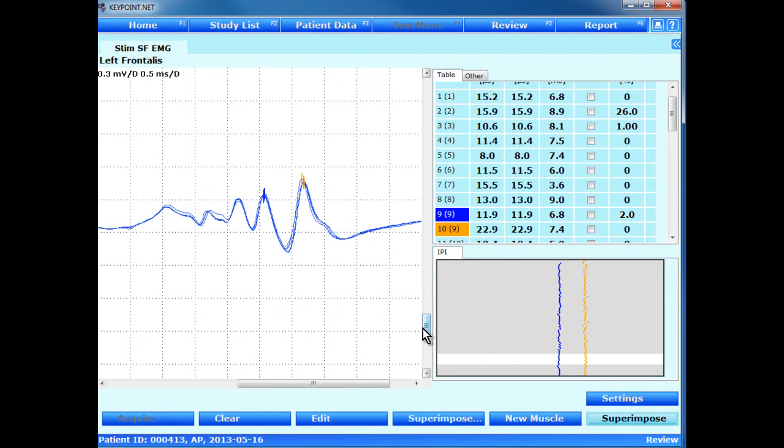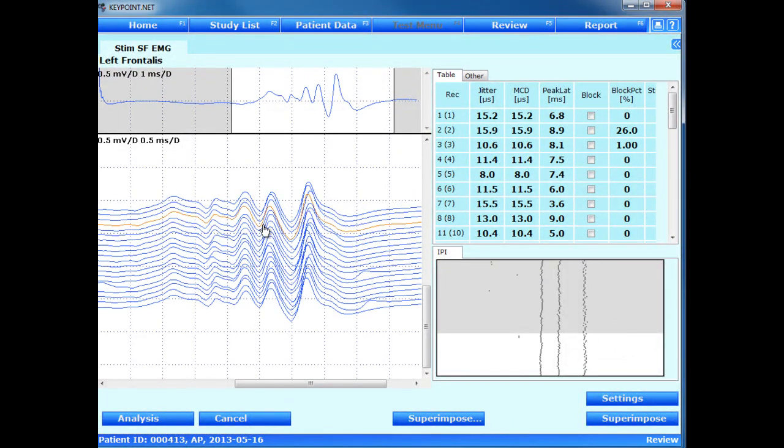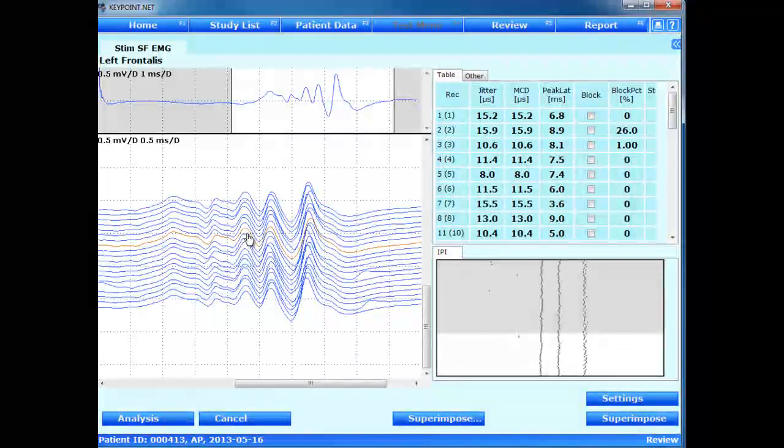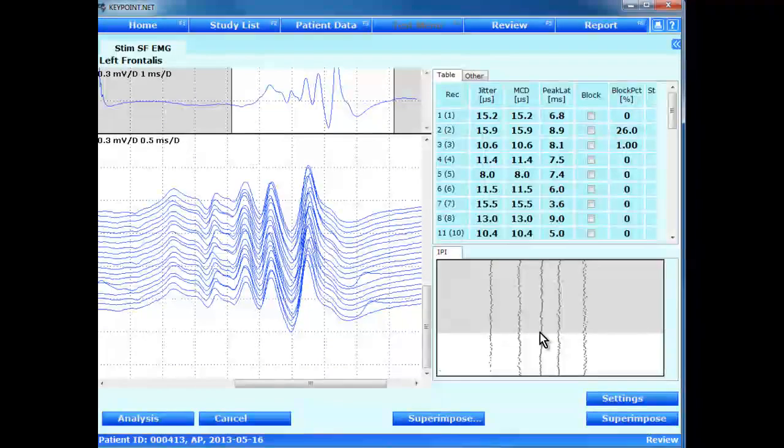some problem in earlier components here. So it is correct that they should not be accepted. If, however, we do like this, I increase the gain, and you look at the dot plot, you see now this spike has reached an amplitude, measured as number of divisions, that fulfilled the acceptance criterion, and I increase it even more, and then we get more spikes.